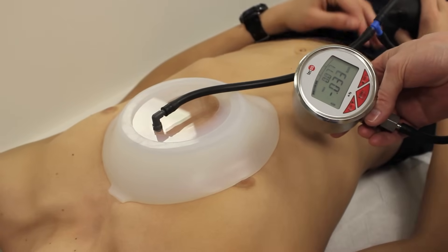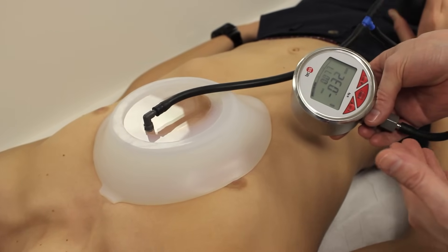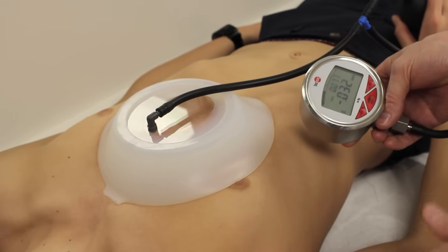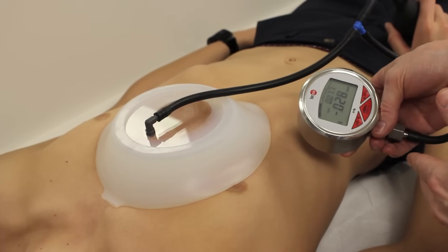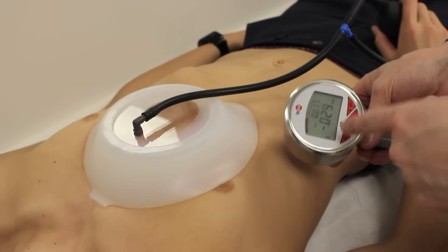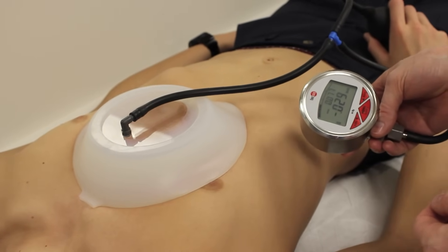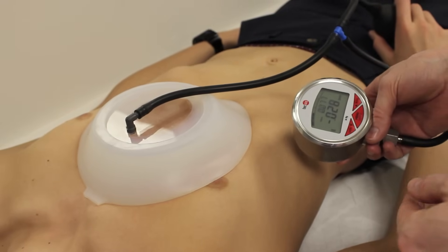We'll have the patient wear the vacuum bell for about 30 minutes twice a day, and increase by about 15 minutes every week until they get to 120 minutes twice a day. Then have the patient come back to our office, and at that point we will start to increase the amount of pressure and the number of pumps, regulating that with this pressure gauge. Doing it this way, we condition the skin and prevent any complications such as bad bruises or ulceration.